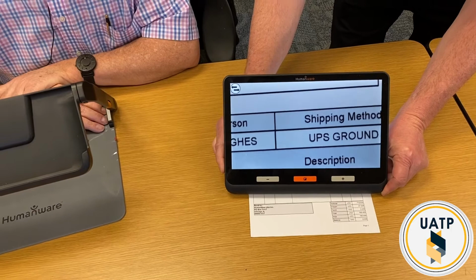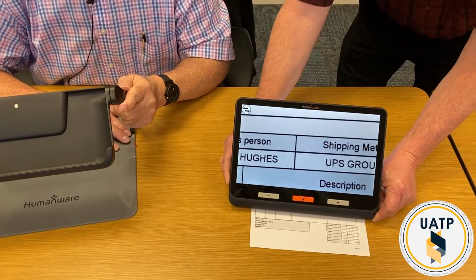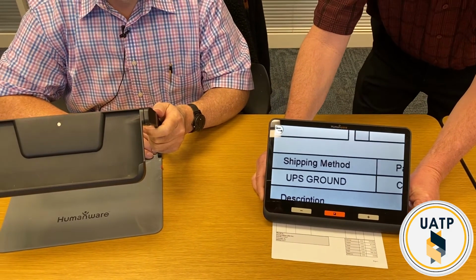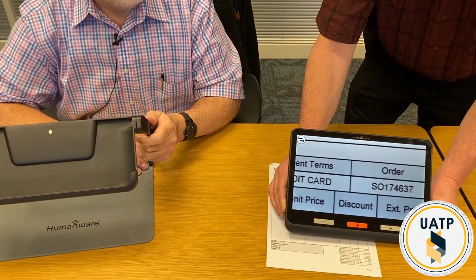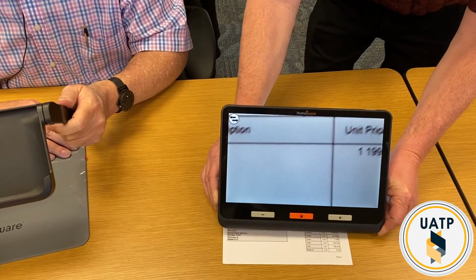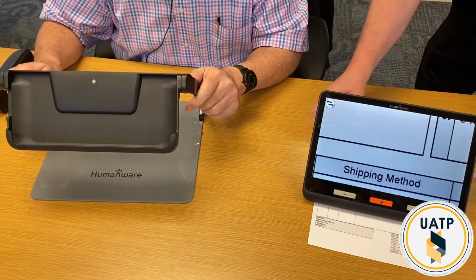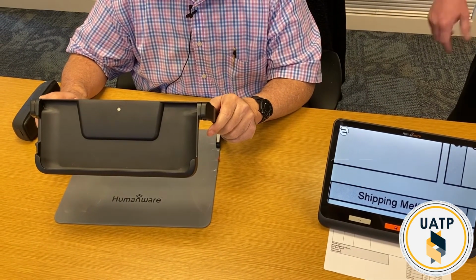So if you take this with you, of course you may not want to take this stand with you, but if you take it with you to the library or somewhere, you could sit it down on a book and just read material off of the book or whatever you're looking at. That's the sort of portable way to do it. This stand folds down, and you can put it into the laptop case that it comes with, and so you can keep it with you and use it or not.